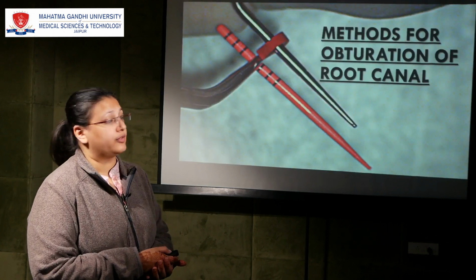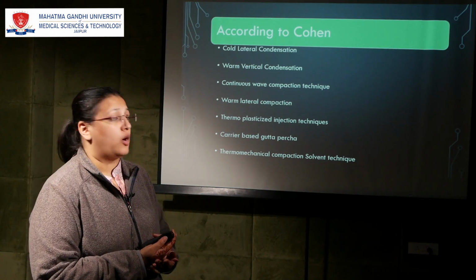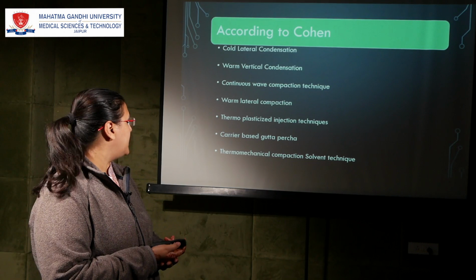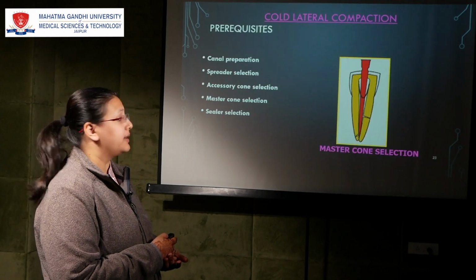Then methods of obturation of the root canals. According to Cohen, there are various methods like cold lateral condensation, warm vertical condensation, continuous wave compaction technique, warm lateral compaction, thermoplasticised injection technique, carrier based gutta-percha, thermomechanical compaction, solvent technique.